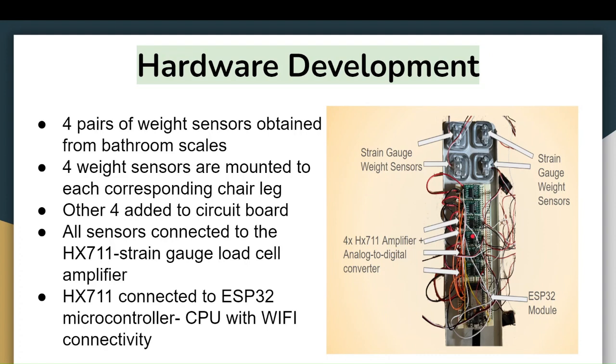What the HX711 does is take the eight sensor signals and translate them into a larger and more usable digital signal to be used by our ESP32 microcontroller. You can see over here, this is essentially the brains of our device. It's the CPU with Wi-Fi connectivity.